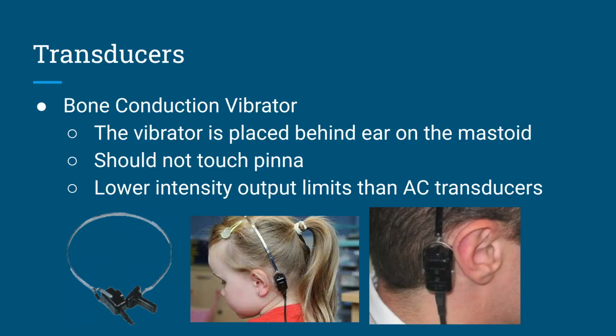There actually was a bone conduction hearing aid called the Soundbite that delivered the stimulus to the teeth for single-sided deafness. I fit all of one patient with it. He loved it, but the company went out of business. It was a really interesting product. It required a BTE-style hearing aid and a custom-made mouthpiece by a dentist where the vibrator would be on the tooth itself, on one of the molars.